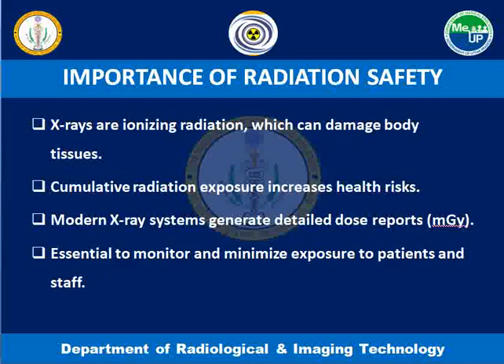Next. Importance of radiation safety. X-rays belong to the category of ionizing radiation, meaning they have enough energy to penetrate body tissues and potentially cause cellular damage. Prolonged or repeated exposure to X-rays can lead to cumulative radiation doses, increasing the risk of long-term health effects, such as tissue injury or radiation-induced conditions.